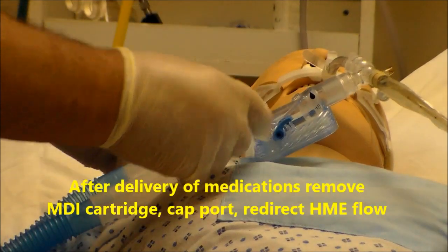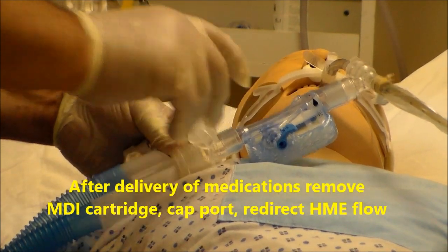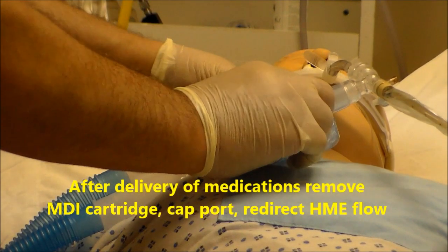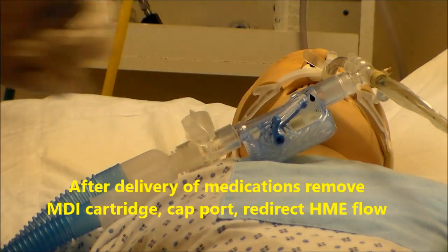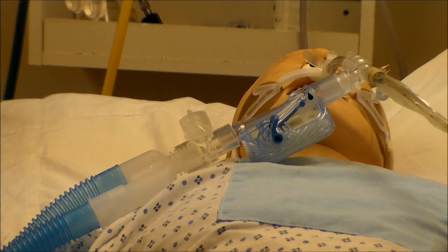After you've given the puffs, take the MDI out of the adapter, re-close it, and then redirect your flow through the HME.